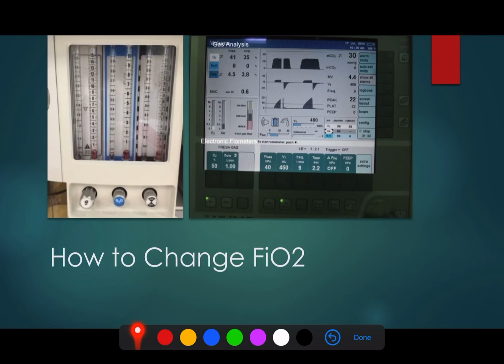And this is, again, what we're seeing here. So if you want to change the amount of oxygen with this system, increase your oxygen ratio compared to your air ratio. Don't touch this blue one. You don't need it. It's used as an anaesthetic.